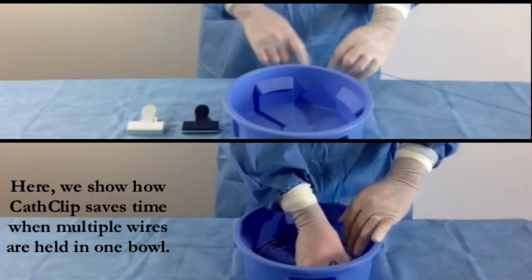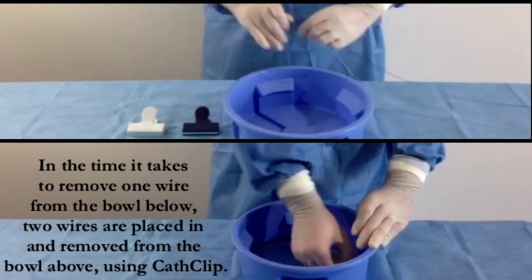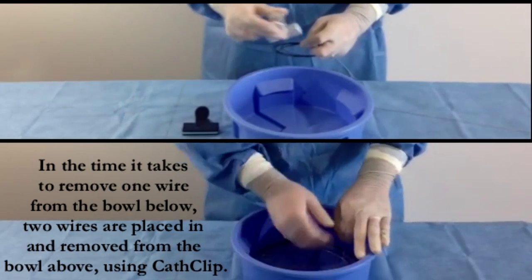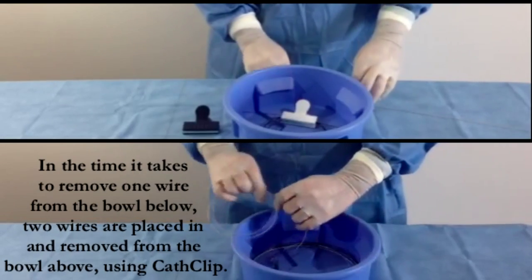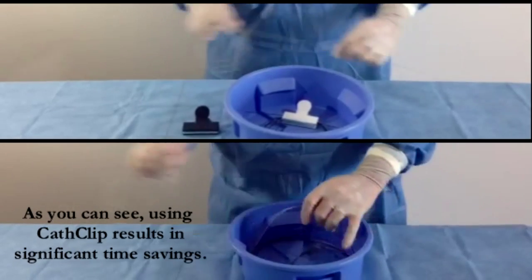Here we show how CathClip saves time when multiple wires are held in one bowl. In the time it takes to remove one wire from the bowl below, two wires are placed in and removed from the bowl above using CathClip. As you can see, using CathClip results in significant time savings.